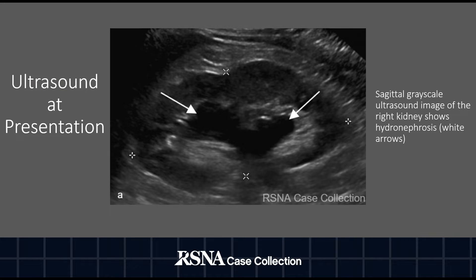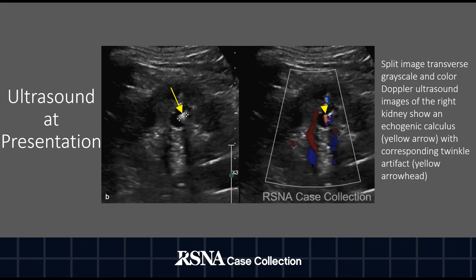Sagittal grayscale ultrasound image of the right kidney shows hydronephrosis, as indicated by the white arrows. Split image transverse grayscale and color Doppler ultrasound images of the right kidney show an echogenic calculus, as indicated by the yellow arrow, with corresponding twinkle artifact, as indicated by the yellow arrowhead.